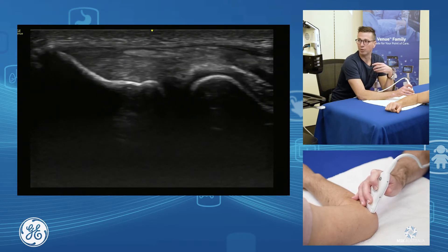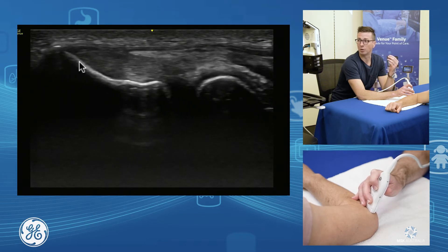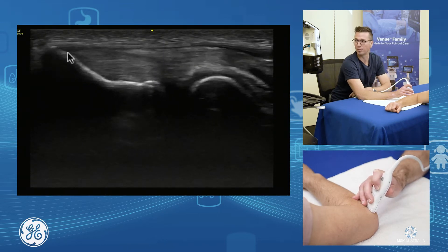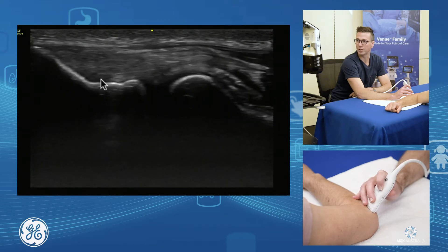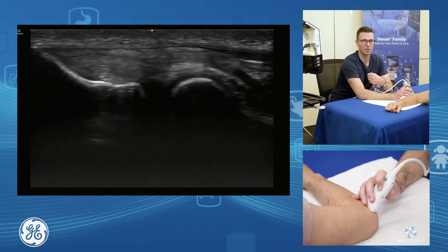If I'm in the middle here, we can differentiate nicely the enthesis footplate of our extensor digitorum communis. And as I bring my probe down towards the table and roll down through here, I get more onto the radial collateral ligament. We can differentiate the different components of the common extensor through here.